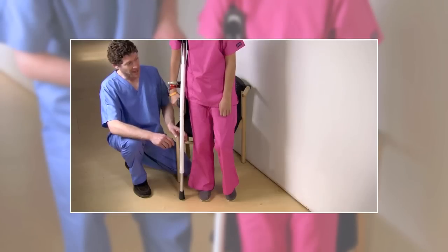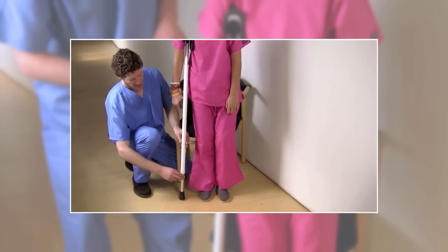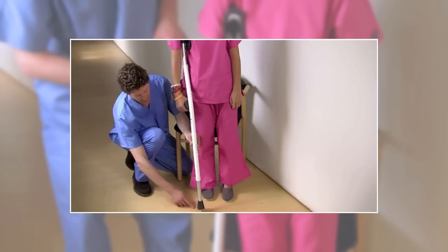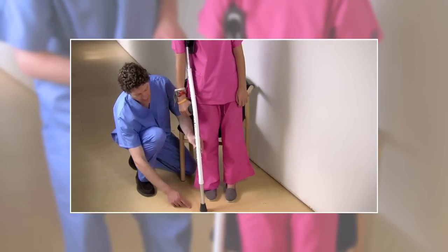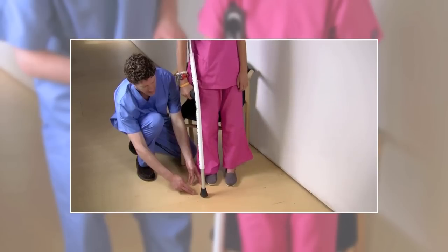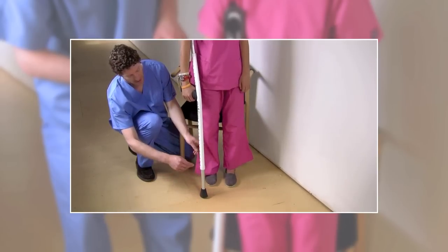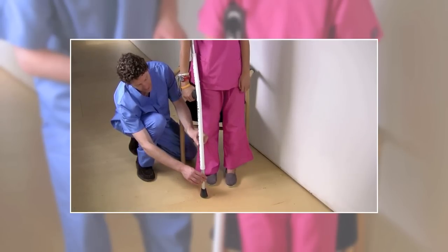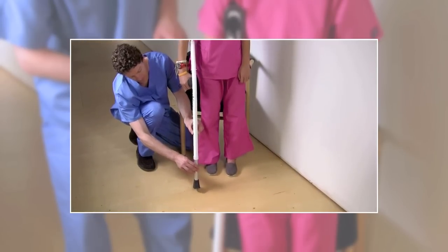With the upper portion properly adjusted, please maintain an upright position. Next, observe the distance from the end of the MobiLex, where the rocker foot is located, to the floor. Using the adjustment buttons, adjust the lower portion of the MobiLex so that the rocker foot is touching the floor approximately 6 inches in front of your toes.